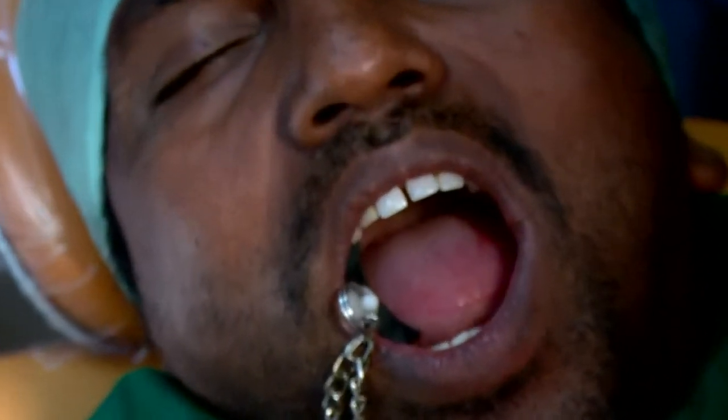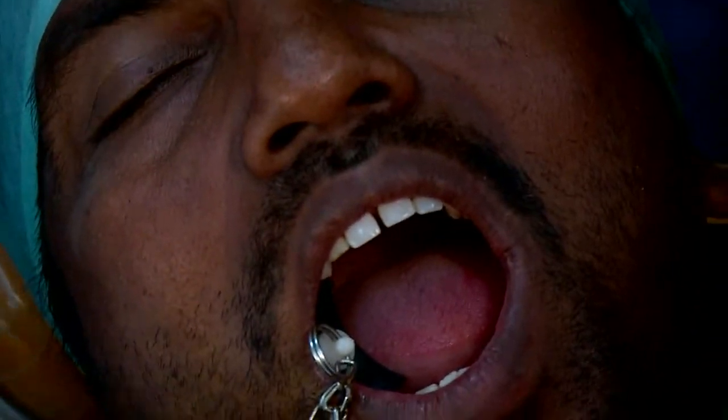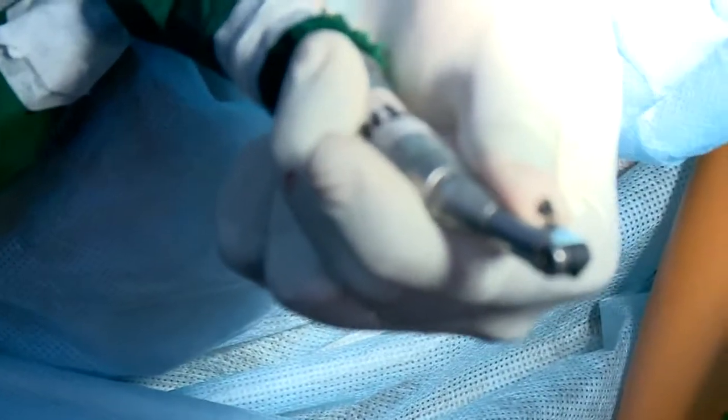Before beginning the surgery, what anesthesia was given? Sir, there are different opinions. In this particular patient, I went ahead and gave an inferior alveolar nerve block. But there are people who suggest that you should only give an infiltration and not a nerve block, because that will be a good indicator whether we are going closer to the nerve.